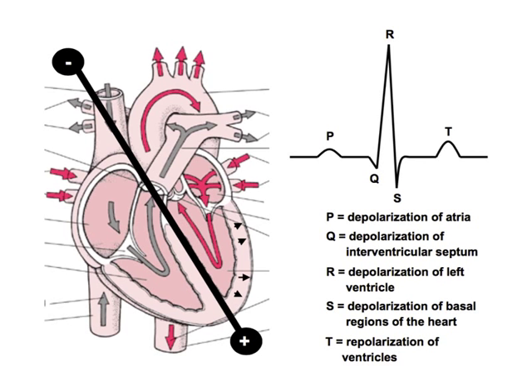We can observe that small repolarization, which we can't do for the atria, lost in the middle of the QRS complex. And I don't even know what wave you would call it. You'll never observe it. No, that's not true either. We'll see situations where we do observe the repolarization of the atria in our 12 lead traces.